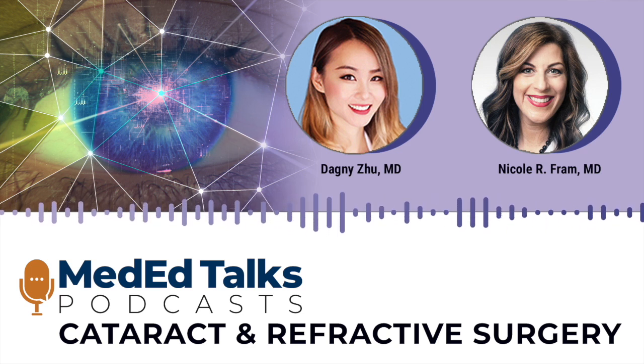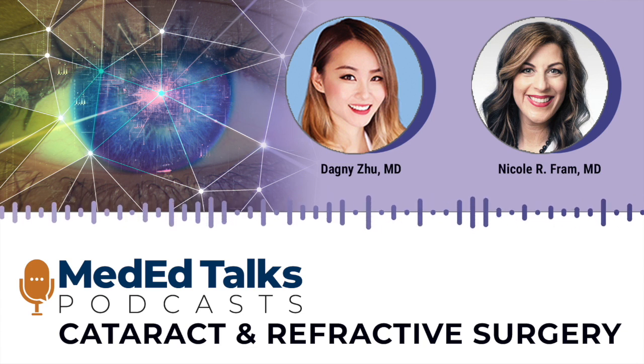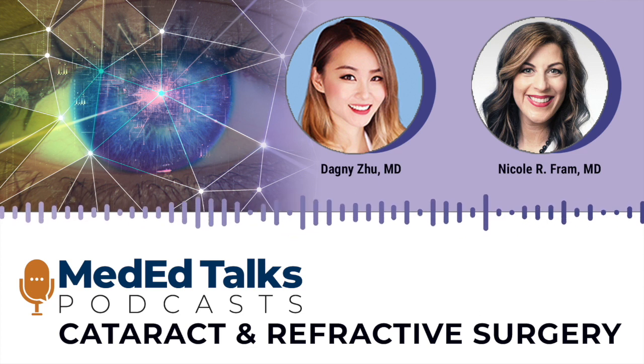So you have to use it enough to know when to not believe it. And that's the hard thing. If you only use it once in a while for a post-LASIK case, you're not going to have the skill set to know when to believe it or not.